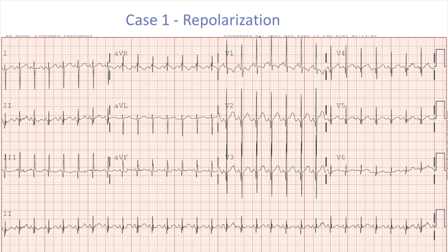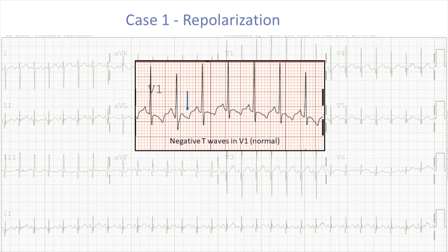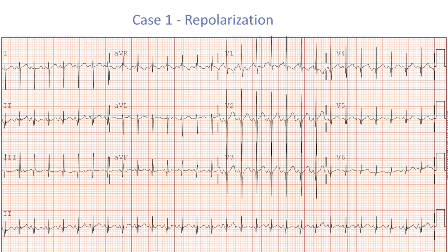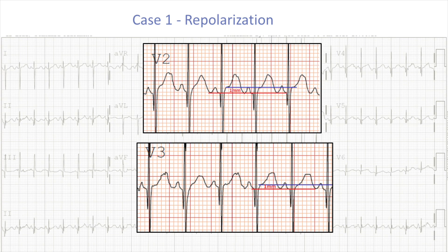Let's complete our approach and look for repolarization abnormalities in our case. Recall that between 7 days and 8-10 years old, the T-waves in the right-sided precordial leads will be inverted. In our ECG, the T-waves in V1 are negative, and all other T-waves are positive, which is expected. Looking through the ST segment, leads V2 and V3 show ST elevation of 1 mm. As discussed, an ST elevation or depression of 1-2 mm in the precordial leads is normal. Therefore, there are no concerning findings in terms of repolarization in our patient.